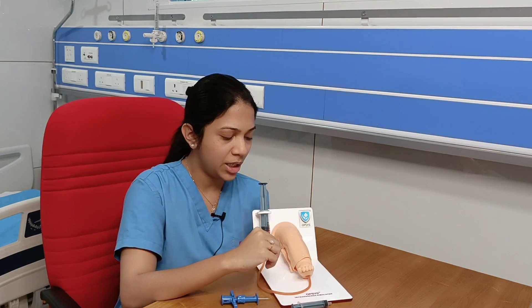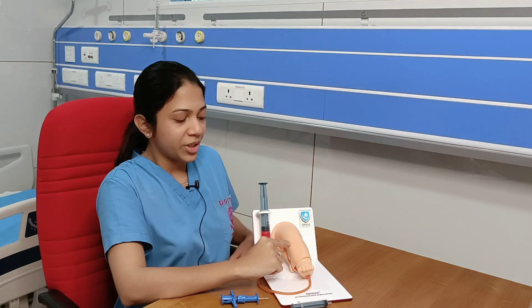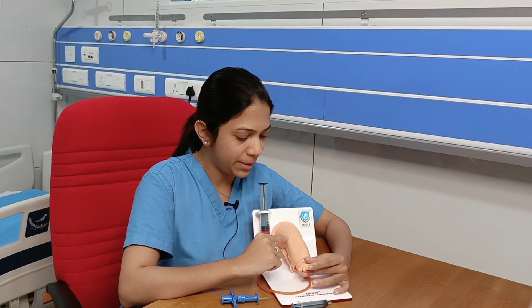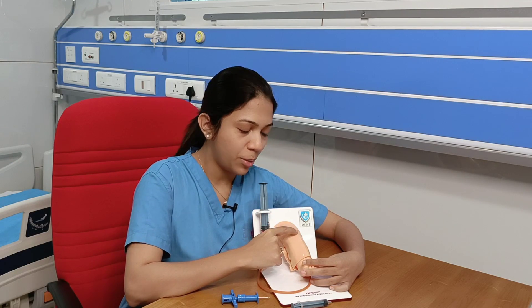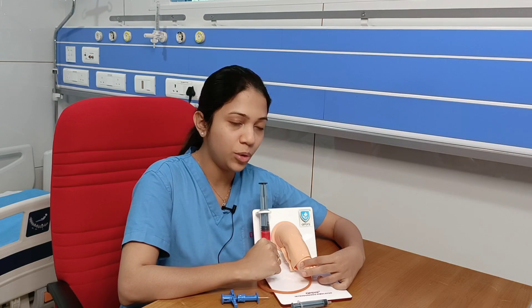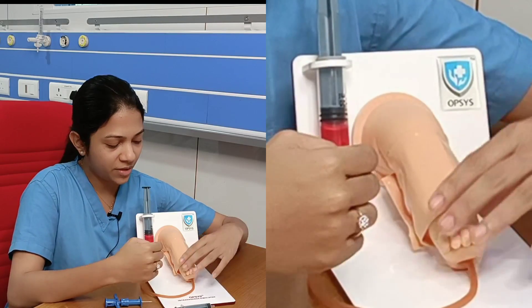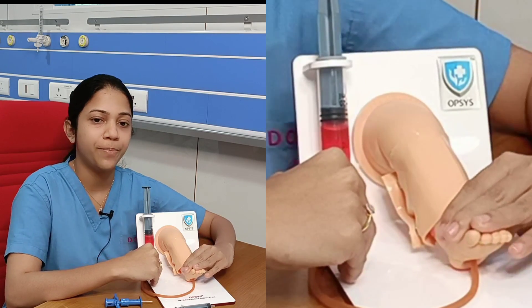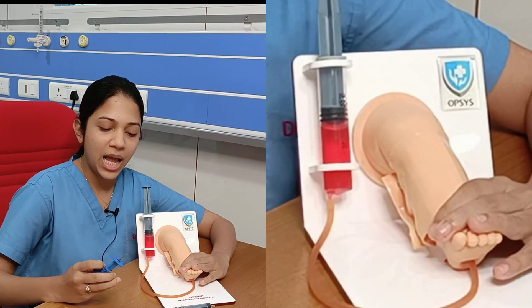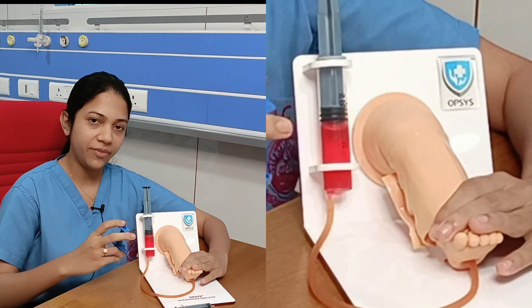During the procedure for proximal tibia IO insertion, keep the leg in a neutral position and slightly externally rotate it, as we are puncturing medial to the tibial tuberosity. An assistant can hold the ankle and externally rotate the leg. Select the IO needle and ensure the beveled edge is facing upwards before inserting.